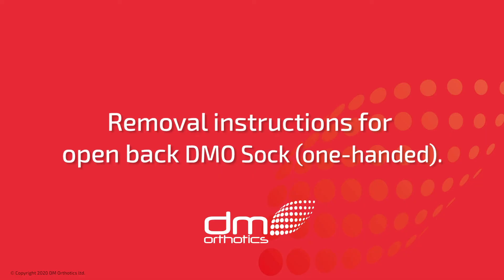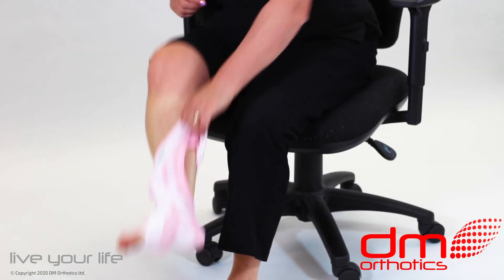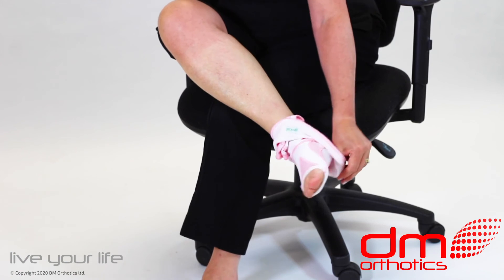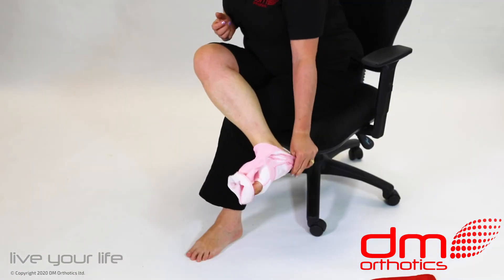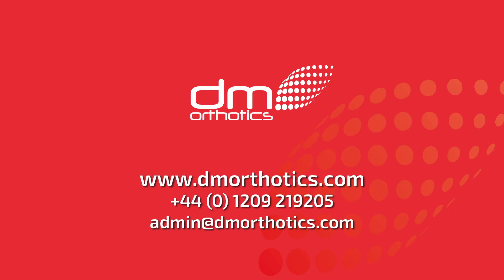To remove the open back DMO sock, take hold of the silicone band at the top of the sock and gently roll the sock down towards the ankle. Push and pull it over the foot and off the toes as shown.